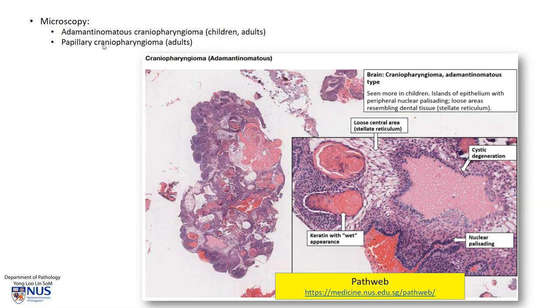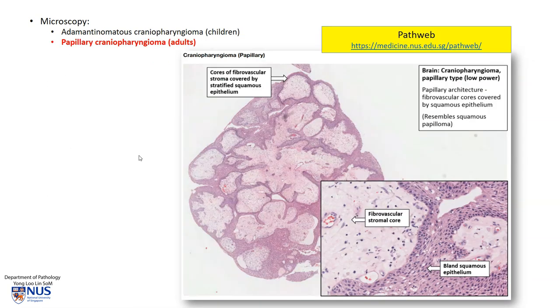Let's take a look at the other variant, which is the papillary craniopharyngioma. This tumor simply shows a papillary architecture with fibrovascular cores. You can see here the fibrous stroma, and these are covered by benign stratified squamous epithelium. So it resembles a squamous papilloma, which is a benign tumor.